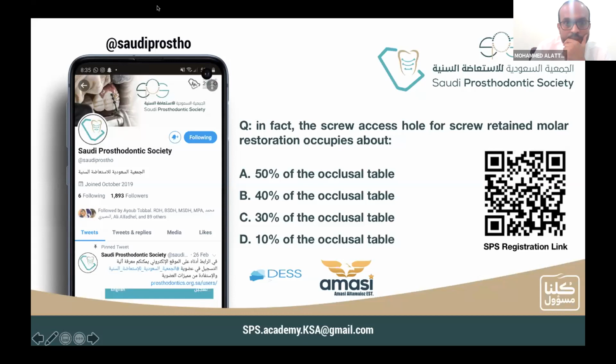This is a good question. If you have 8 implants in the upper, do you prefer a segmental prosthesis or a one-piece? What did Stanford say in 2005 and 2007? He said you should place 8 upper implants at the central, canine, first premolar and first molar, and make a segmental prosthesis.